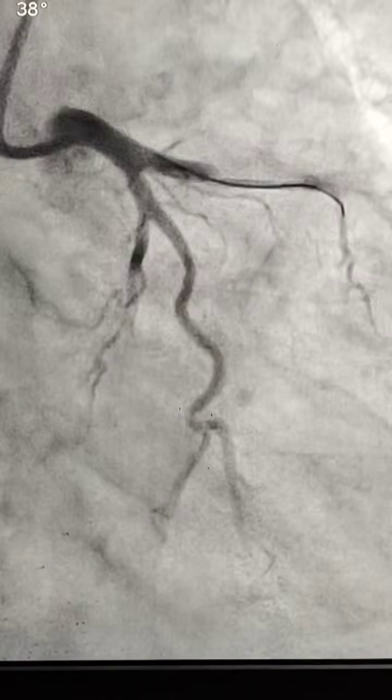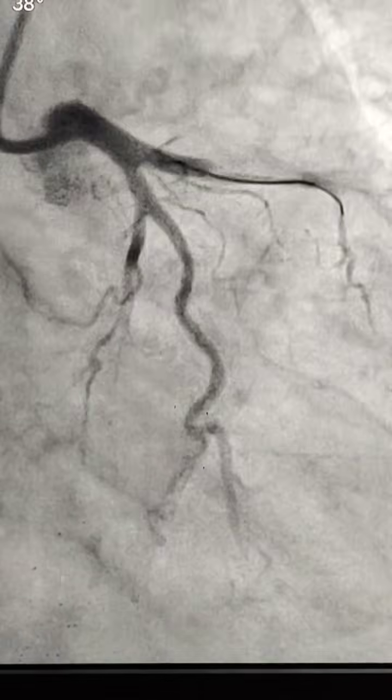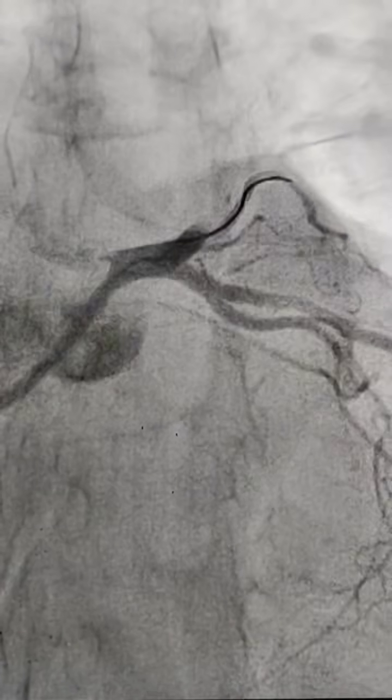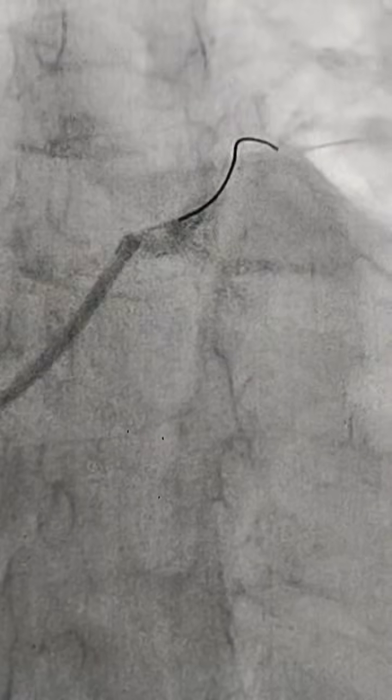So I was trying to put the wire in the LAD, but the wire was going into the diagonal, and this wire is in the diagonal. So I kept one wire in the diagonal, and I took a second Whisper wire. This was a run-through wire, and I took a second Whisper wire and I tried. In this RAO caudal view we can see clearly this wire is in the diagonal, and there is a stump in the LAD. That was a very hard stump.